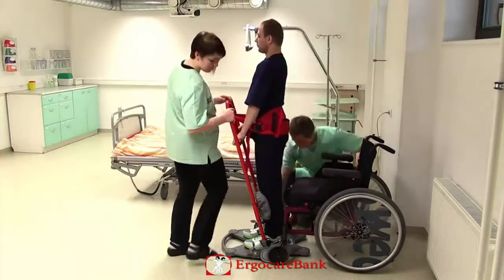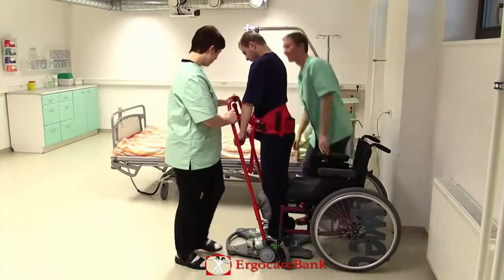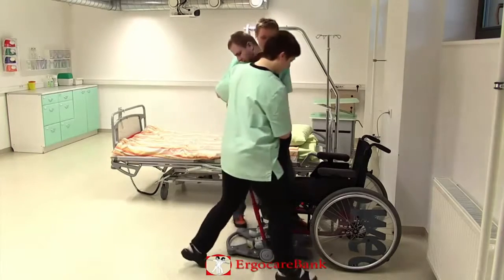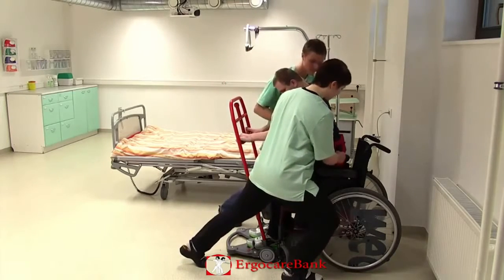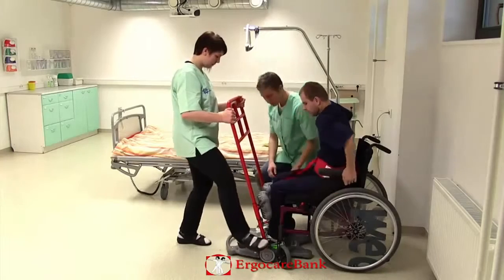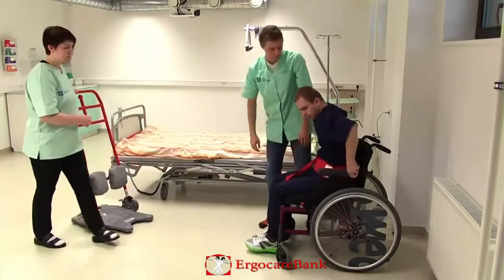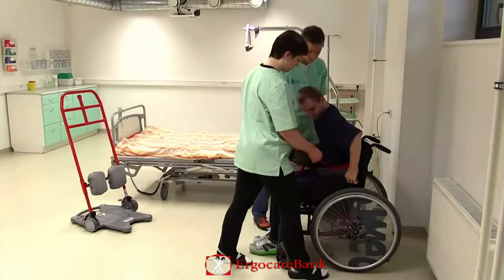They brake the return, the strap is loosened and Charlie is lowered into the wheelchair. The belt is removed and the foot plates of the wheelchair are put back on.